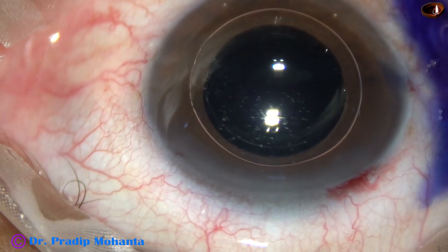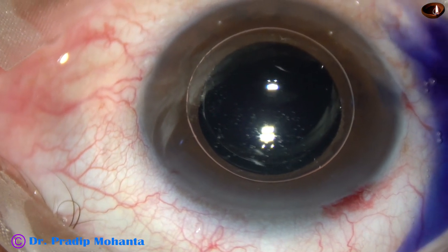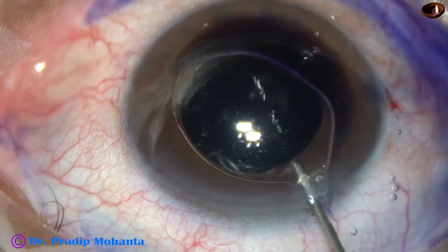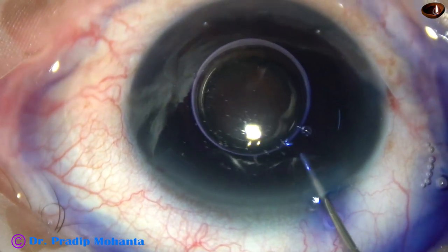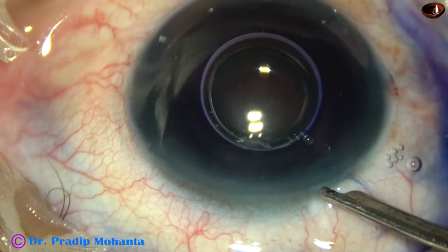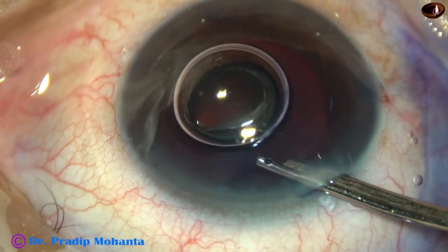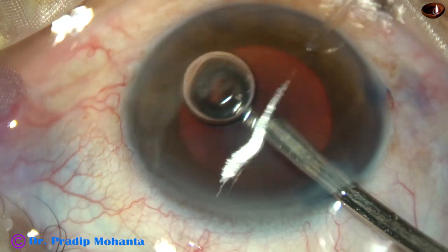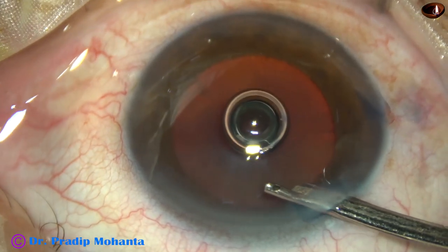Now I am injecting a little bit of adrenaline to see if the pupil dilates a little more. The pupil had dilated about 6.5 mm, and after administration of adrenaline, the pupil has dilated to about 8 mm.